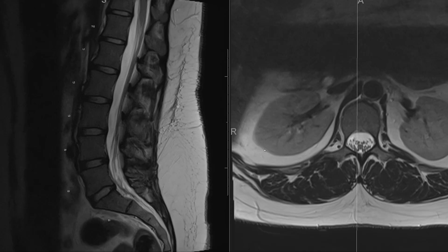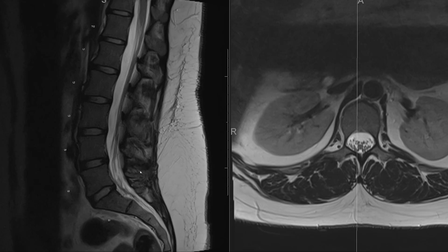Here we have sagittal and axial T2-weighted images of the lumbar spine. Let's review some basic anatomy. First of all, we have five lumbar vertebral bodies — L5, 4, 3, 2, 1 — connecting to the sacrum S1 vertebral body, and then T12 above. Each vertebral body is fairly square, and then we have an intervertebral disc at each level.